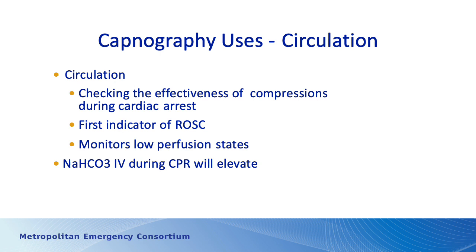So capnography is a great way of assessing circulation. I think all of us now are used to using capnography when we do CPR. Capnography is a great way of assessing the effectiveness of compressions during cardiac arrest.